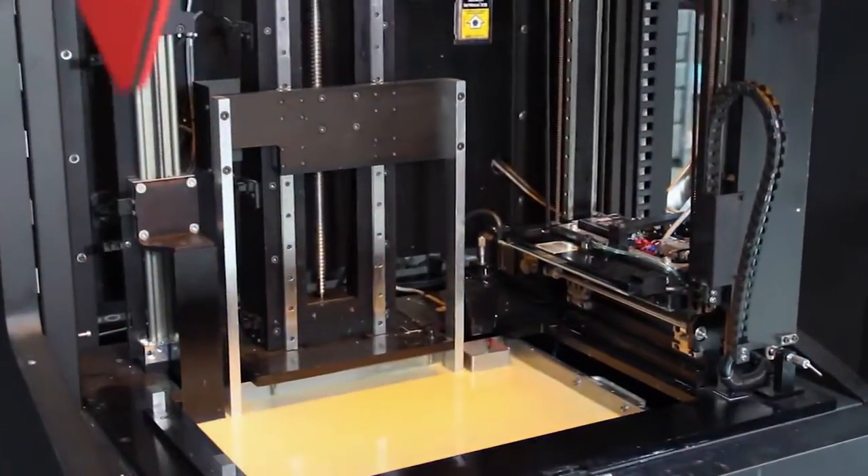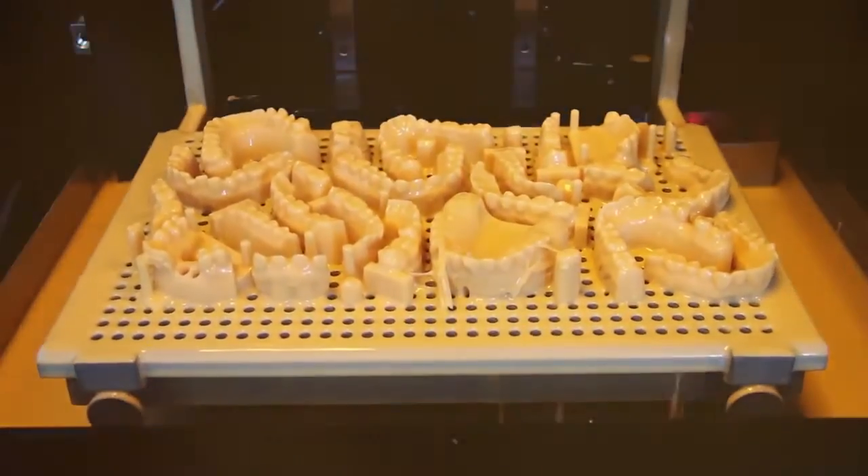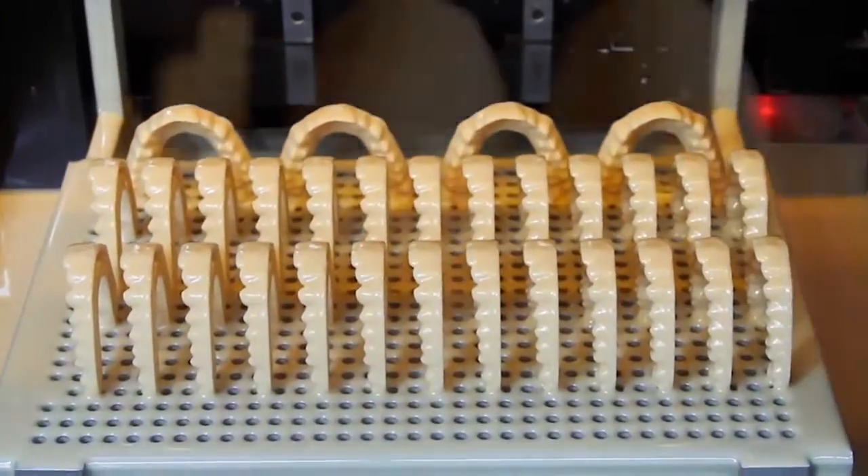The Vector3SP comes in two different versions. We have the Vector Ortho which allows for XYZ resolution of about 100 microns. The Vector Ortho can print 15 to 20 models in underneath 2.5 hours. You can also print about 50 models in the vertical orientation for high throughput aligner production.